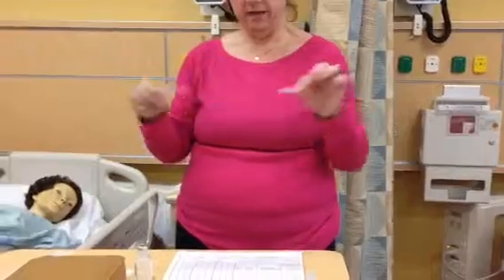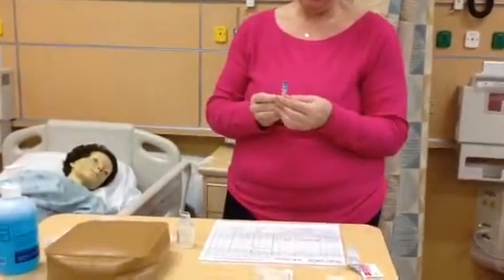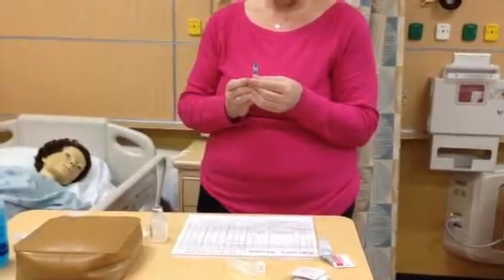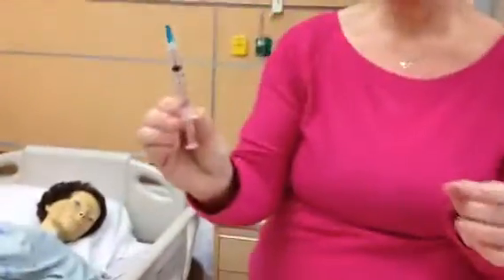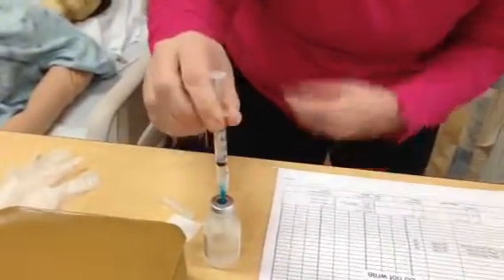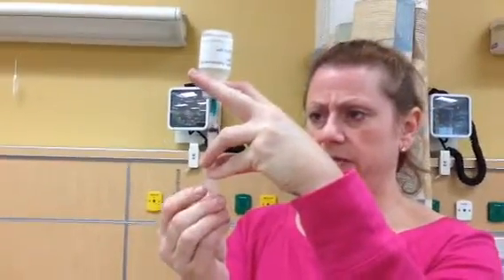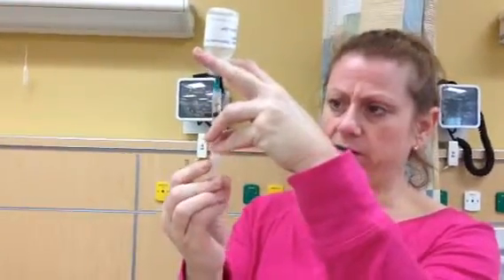So I take the cap off. I pull this back to 1. So 1 milliliter of air. I will then insert this into the bottle. Oops, put the air in first. Turn this upside down and pull down to get 1 milliliter. I will go a little bit past the 1.